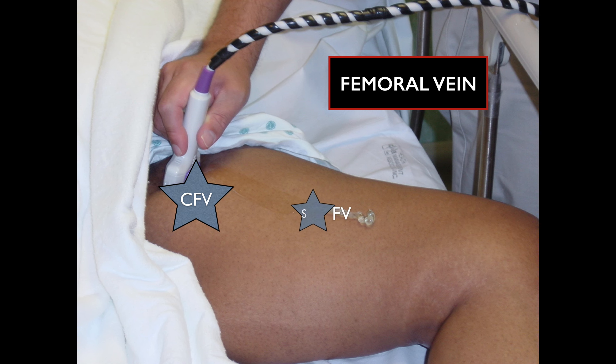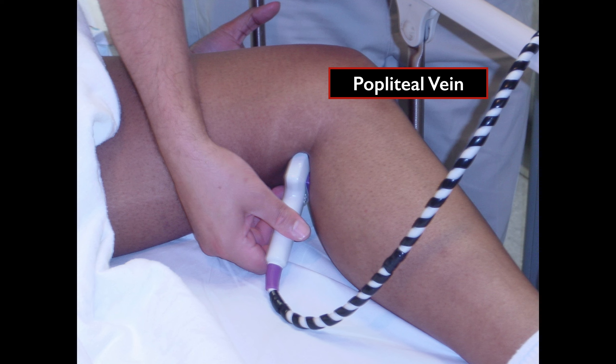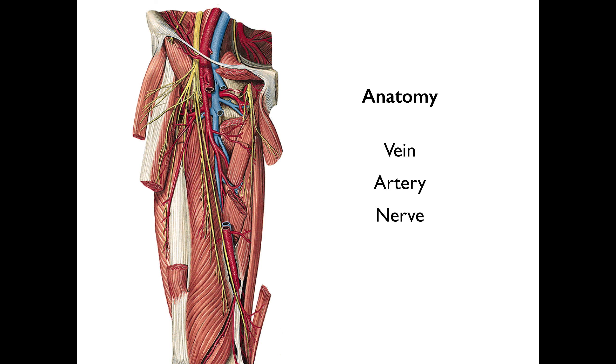First you scan the common femoral vein, and as you slide down further you'll eventually come to the superficial femoral vein, then you end with the popliteal vein. Since the patient is already frog legged, it's easy to transition and find that popliteal vein. In general, the anatomy is vein-artery-nerve, with the vein being medial and the nerve being lateral.